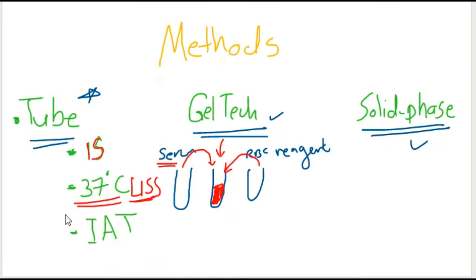So after that, we must do the indirect antiglobulin phase, or indirect antiglobulin test, when we use the Coombs reagent. This is the mandatory one. It's not important to do an immediate spin, and many blood bank centers omit this step because it leads to detecting IgM, which may be present in patient serum but is not clinically significant. So sometimes they just omit this phase, and they also don't do a 37 phase. They directly do the mandatory one, which is the indirect antiglobulin test.